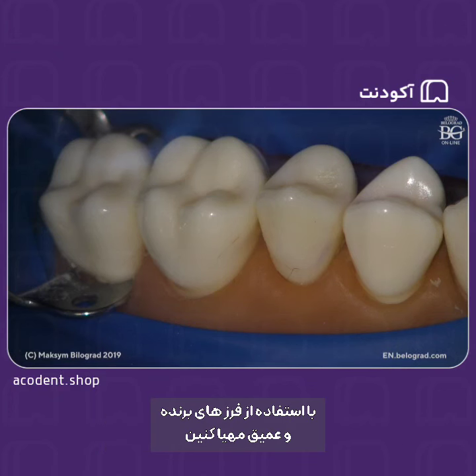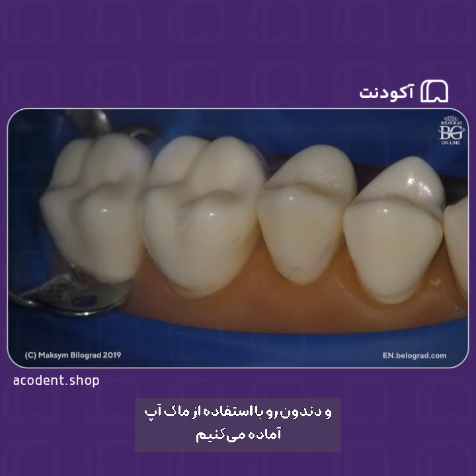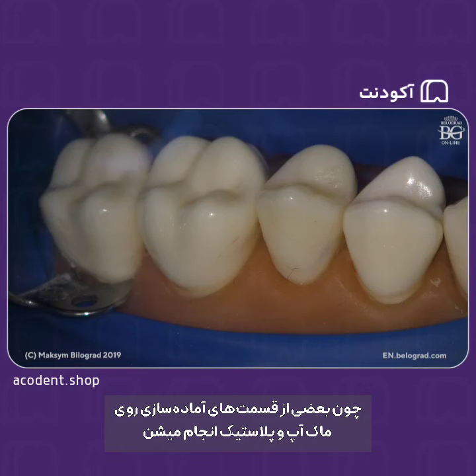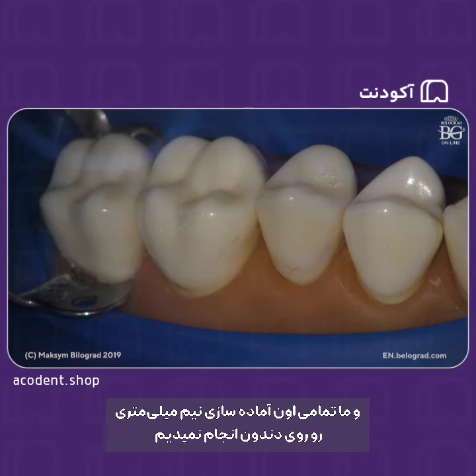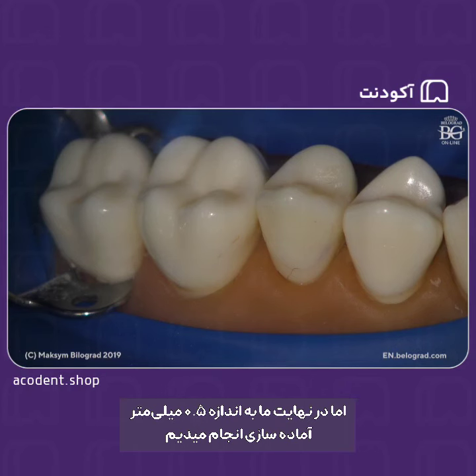For this, we use depth cutting burrs, and we always do a wax-up, we always do a mock-up, and then we prep teeth through the mock-up. That helps us preserve as much tooth structure as we can, because some parts of the preparation will be done within the mock-up, within plastic, and only some areas will be exposed in tooth structure. We are not preparing the tooth 0.5, for example. We prep just 0.3 within the mock-up and 0.2 in tooth structure, but in total you'll have this 0.5.